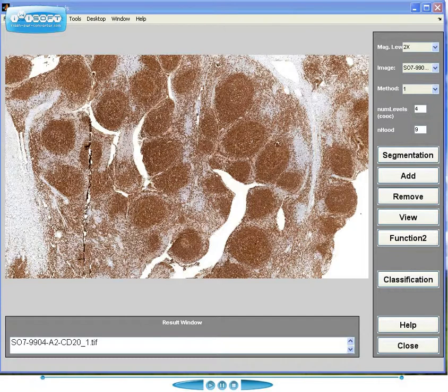According to the World Health Organization's recommendation, the histological grade of follicular lymphoma is based on the average number of centroblasts in 10 different and representative neoplastic follicles in a high power field. Based on the average number of centroblasts, follicular lymphoma is stratified in 3 histological grades, with grade 1 having 0 to 5 centroblasts in a high power field, grade 2 6 to 15 centroblasts in a high power field, and finally grade 3 with more than 15 centroblasts in a high power field.